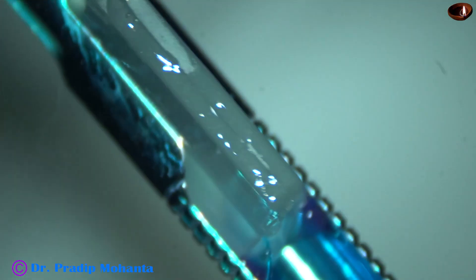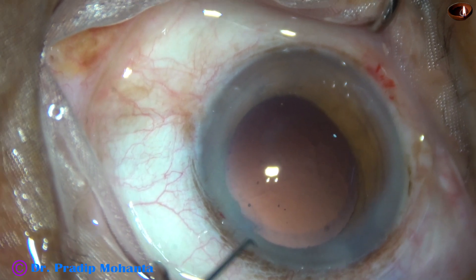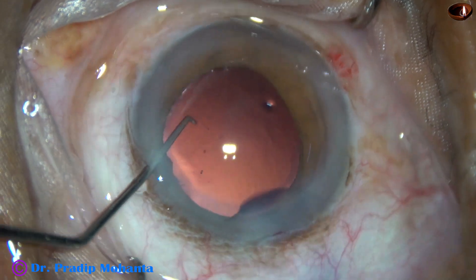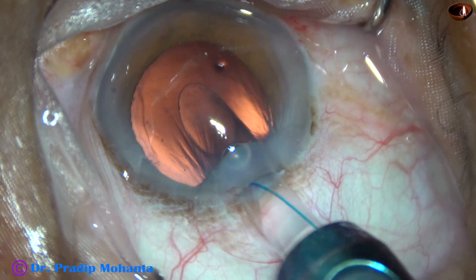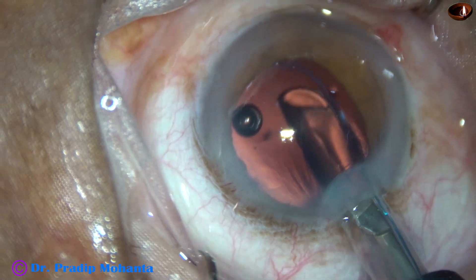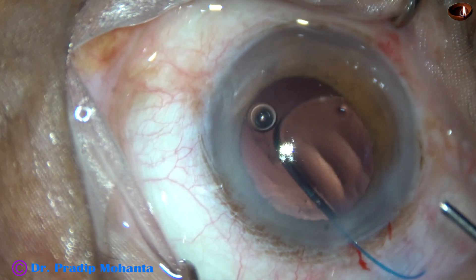In this case I selected a multifocal intraocular lens because my plan was to do small incision cataract surgery with a 7 mm incision. But at the last moment I decided to do phacoemulsification, and I am using this lens — this is the Sensar multifocal from Abbott, now Johnson & Johnson. I am enlarging the main wound to about 3.1 mm; initially it was 2.8 mm. It has been enlarged so that the cartridge goes easily into the capsular bag. Now I rotate the cartridge clockwise so that the haptic comes out, and then anticlockwise so that the haptic doesn't hit the posterior capsule.